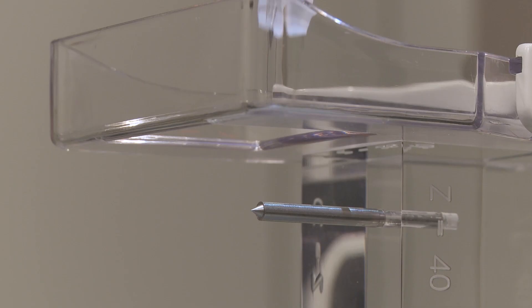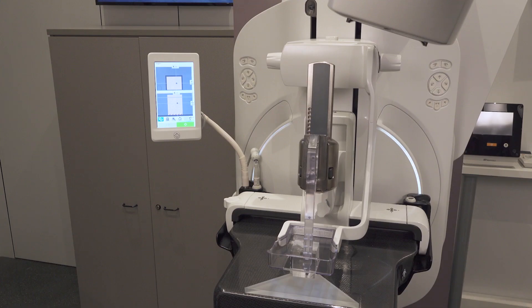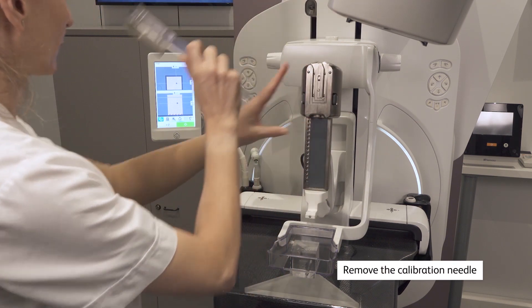Slide the calibration needle all the way towards the needle guide support. The tip of the calibration needle should touch the tip of the pin phantom tip. Let's now check the accuracy for the horizontal approach.